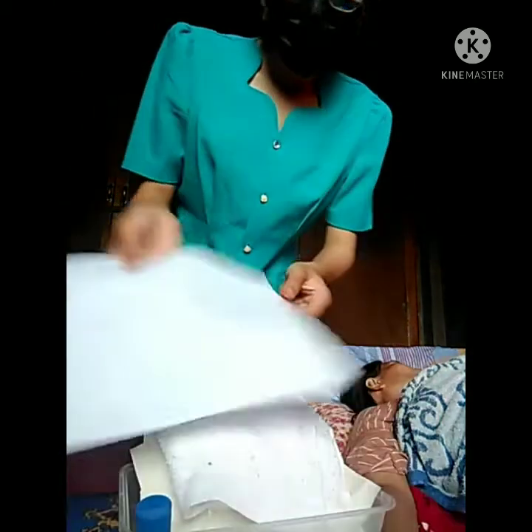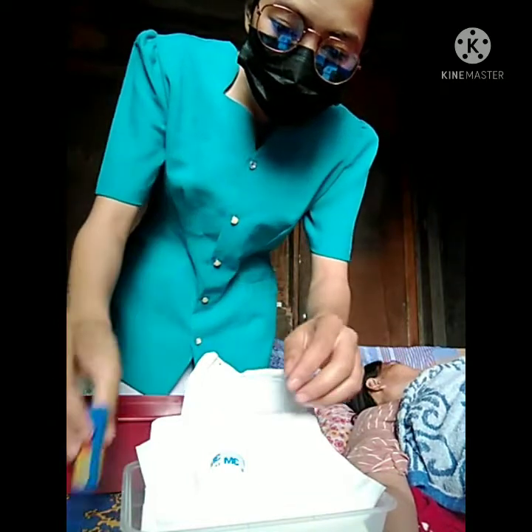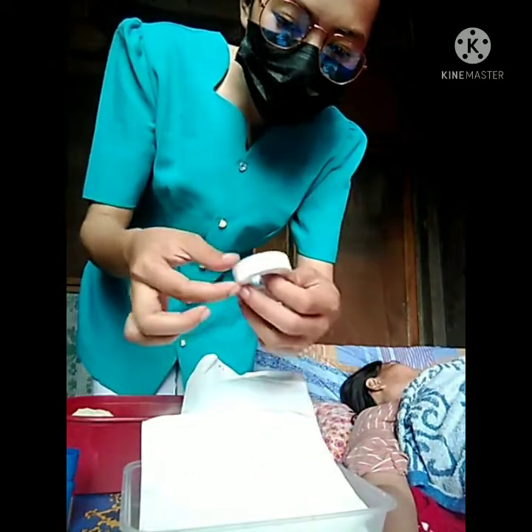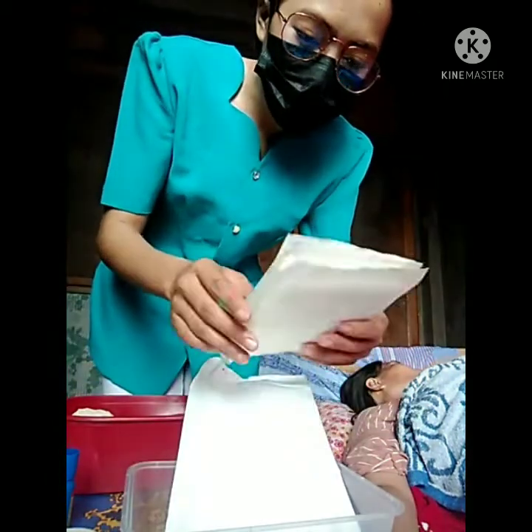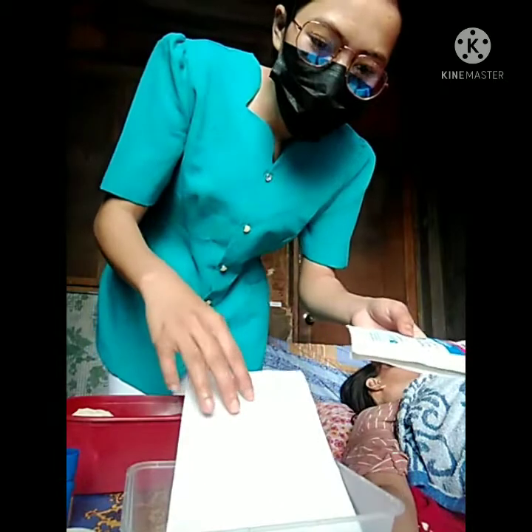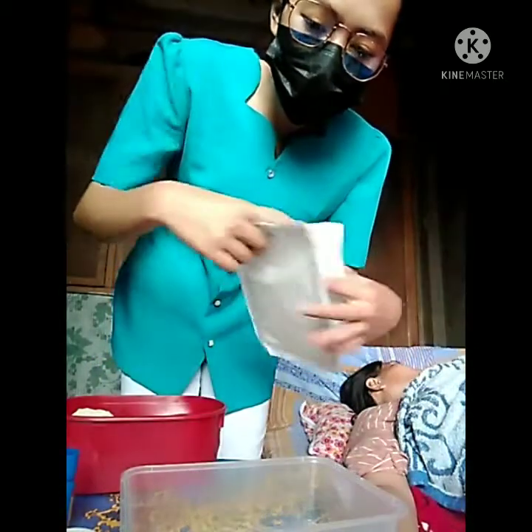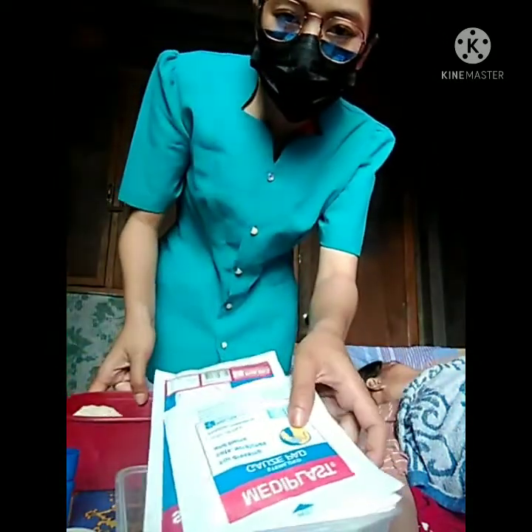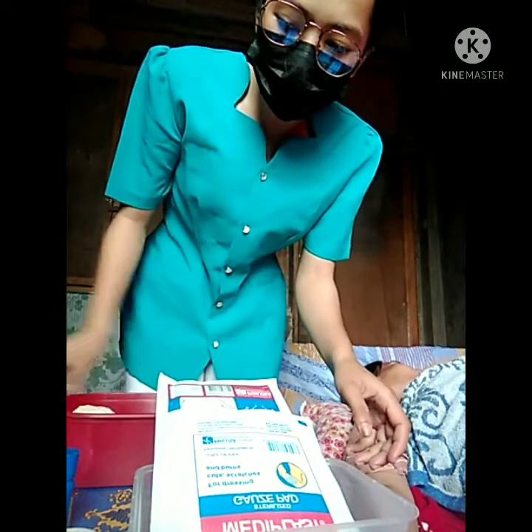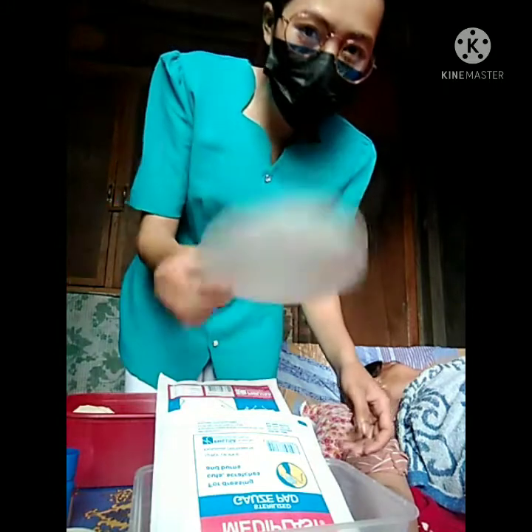I have here my betadine solution, the adhesive tape, the sterilized gauze, the sterile gloves, and the forceps. And then I also have my waste receptacle, a bottle, and a basin.